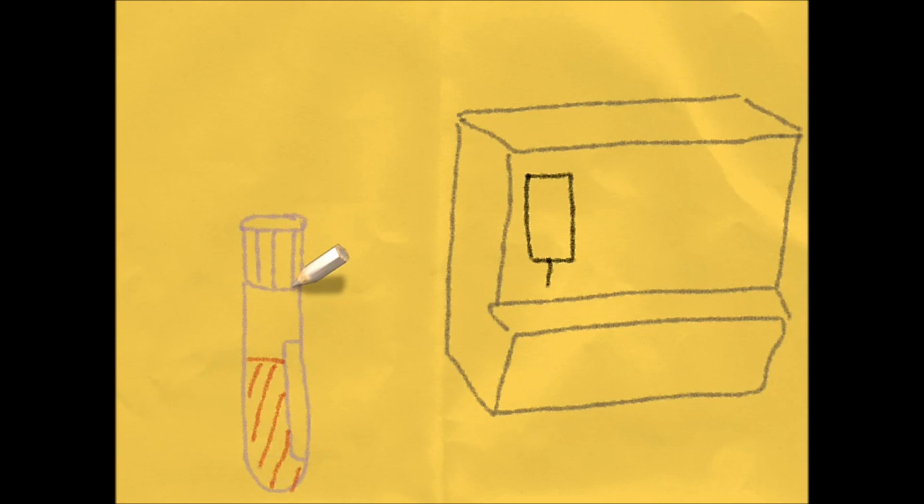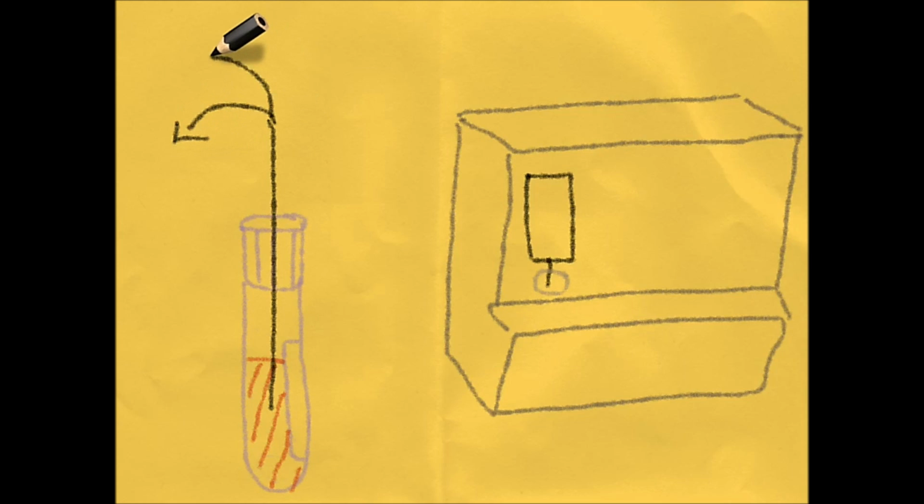The analysis is undertaken using a closed system. A small capillary tube from the analyser is inserted into the centre of the sample, and a determined, standard amount of blood is taken and analysed.